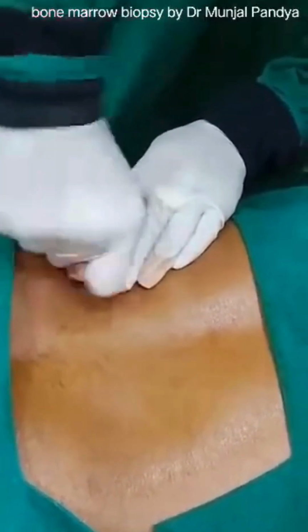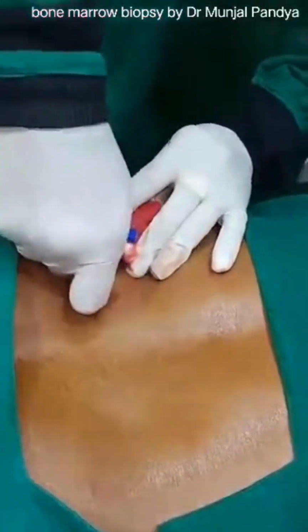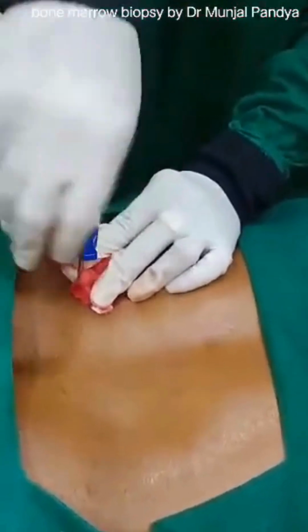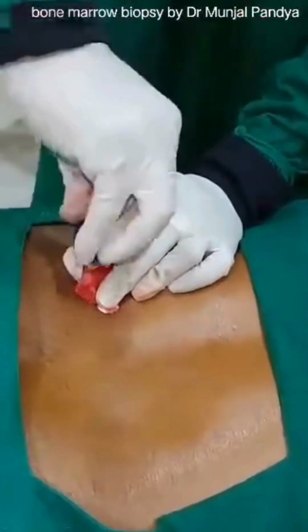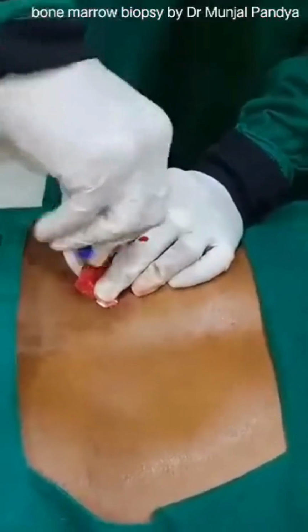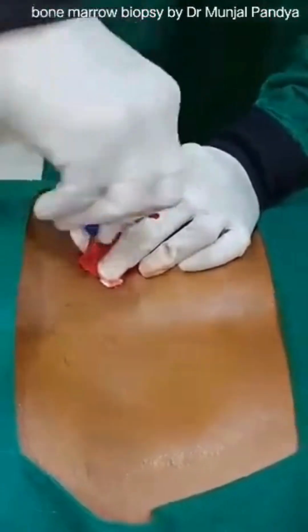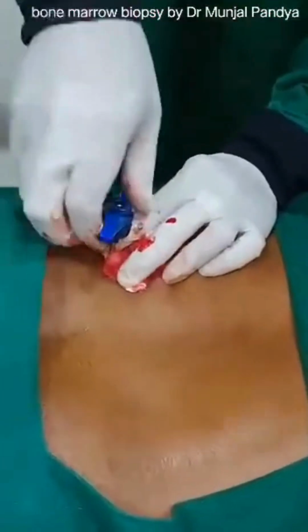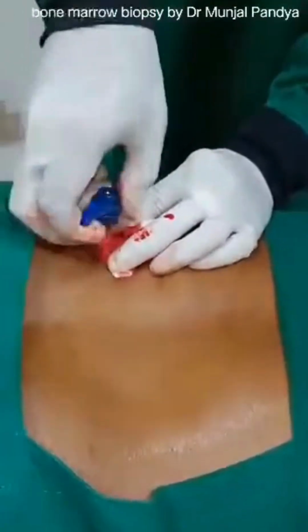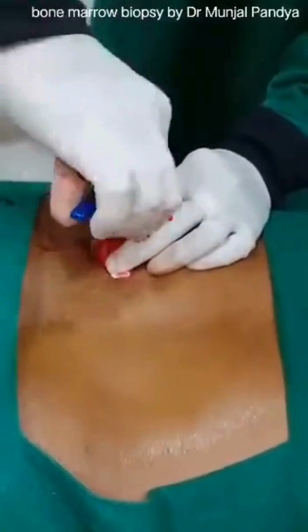Into the bone, and once I reach the index finger site, I will move it around 10 times. And anti-clockwise I am separating this from the surrounding bone.